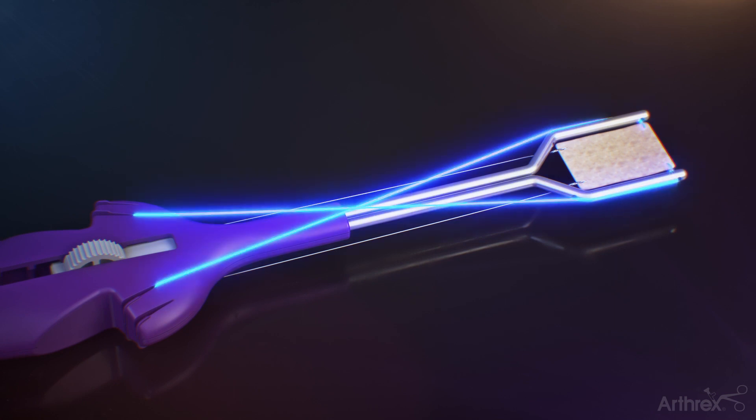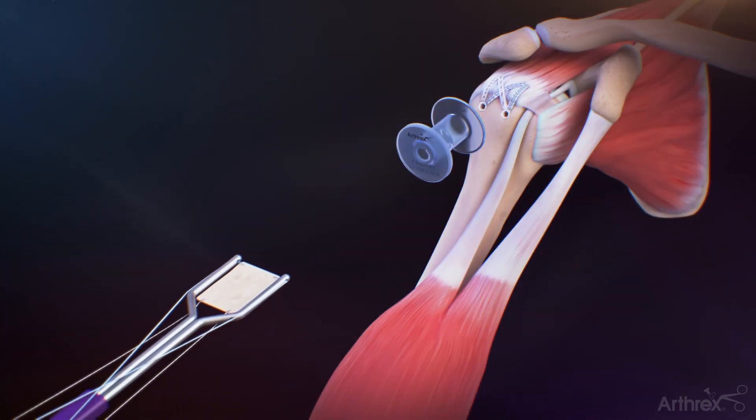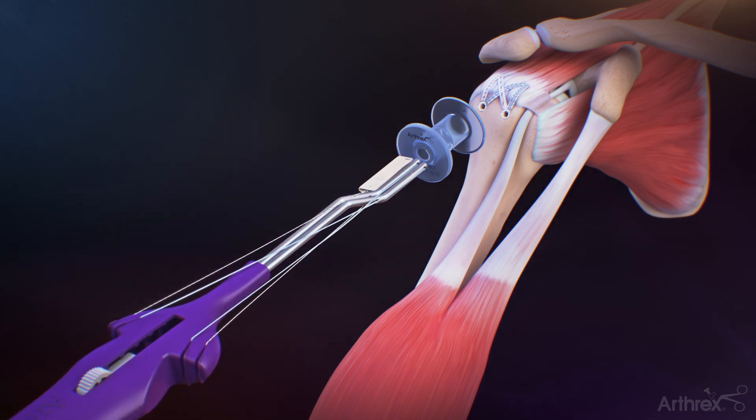Dock the lateral suture tape TigerLink sutures straight back into the outer cleats of the graft spreader. After loading the ArthroFlex graft onto the graft spreader, retract the arm by sliding the button in the direction away from the graft. Insert the graft and graft spreader through the lateral passport cannula.